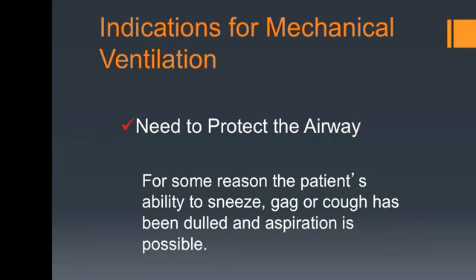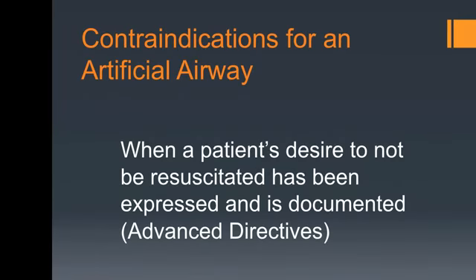Again, more indications for mechanical ventilation. If you feel that the patient needs their airway protected, perhaps they have lost their gag, sneeze, or cough reflex, sometimes after anesthesia is when this can be exhibited. Contraindications are very clear when a patient's desire not to be resuscitated has been expressed and is documented. This would be in the advanced directives.